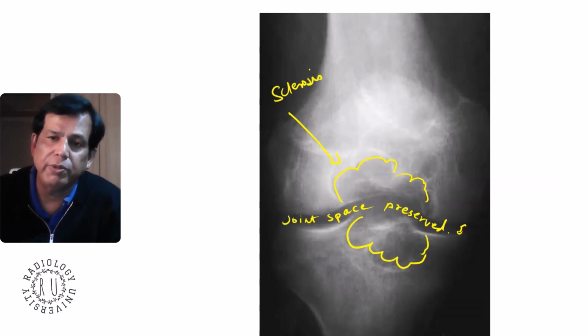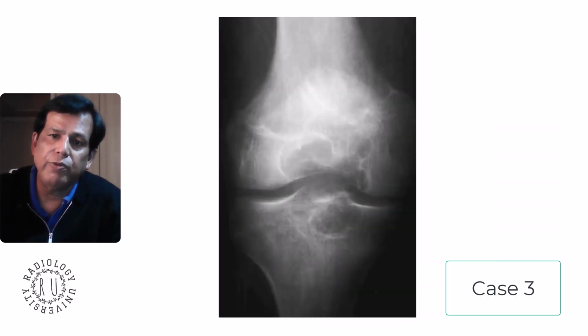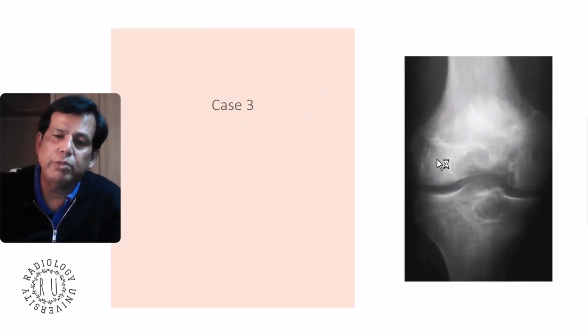Yes, PVNS. And the modality to look at this stage is nowadays MRI. What MRI will tell you is the blood component in the joint, which differentiates darker and brighter components, so a mixed component because it keeps bleeding inside. This is where it's happening. It's pigmented villonodular synovitis. The pigment in the synovium is bleeding and collecting inside, causing pressure. So MRI is differentiating the blood in different components. You're getting blood which is darker, blood which is brighter, and erosions with a normal joint space, because it doesn't destroy the cartilage. So that's why it is PVNS.